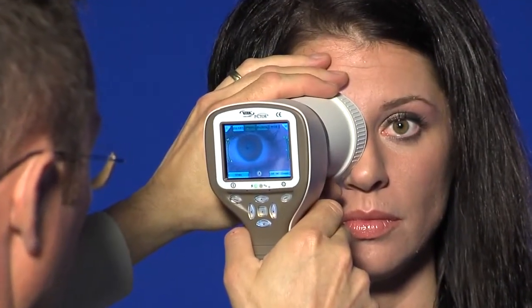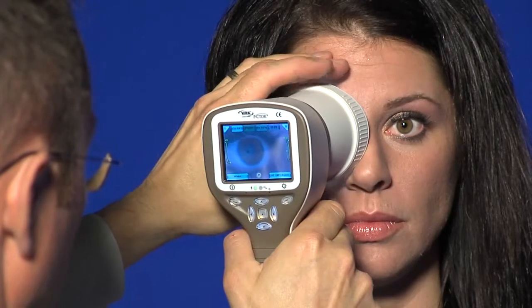The camera is stabilized by keeping the outer side of the hand against the patient's forehead.